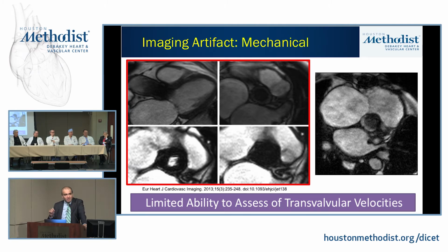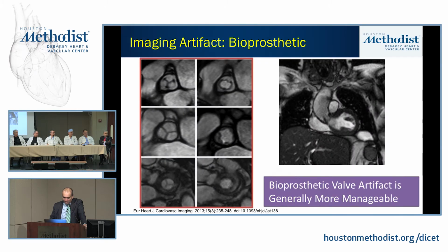And also, because of the artifact, I think CMR will be hard in a mechanical valve to quantify transvalvular gradients or transvalvular velocities. On the flip side, though, with bioprosthetic valves, generally the amount of artifact is much less, and you can usually see the leaflets reasonably well. So if it's a question of bioprosthetic valve stenosis, that we can generally manage, and you can generally get some assessment of it with CMR.